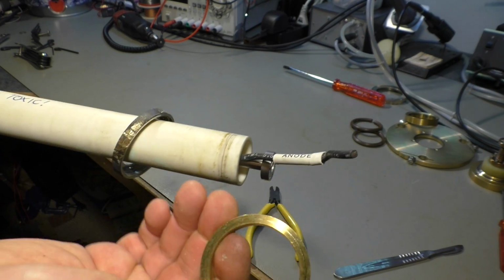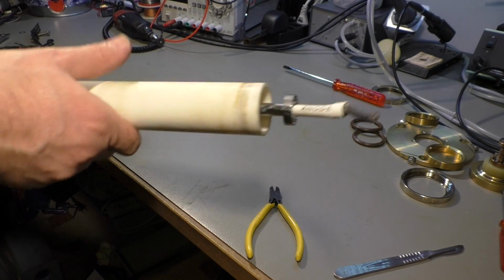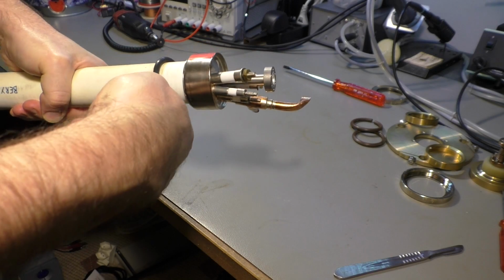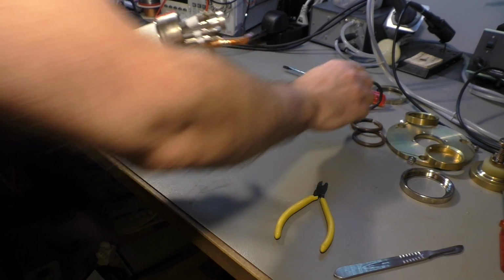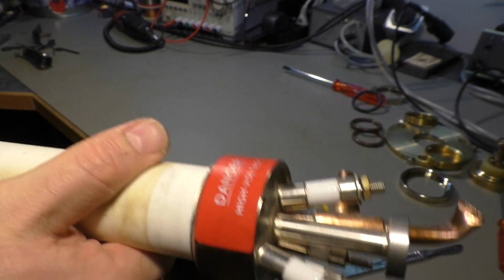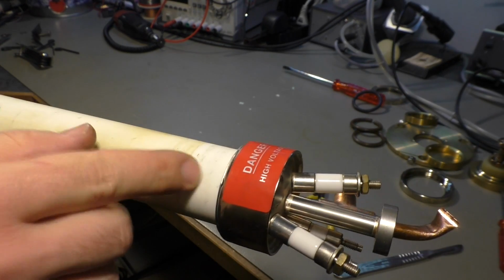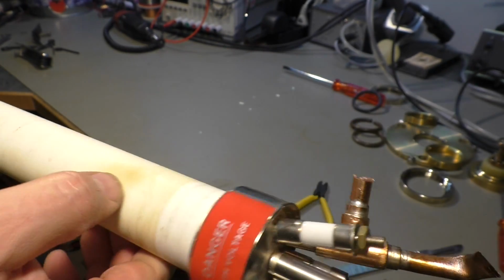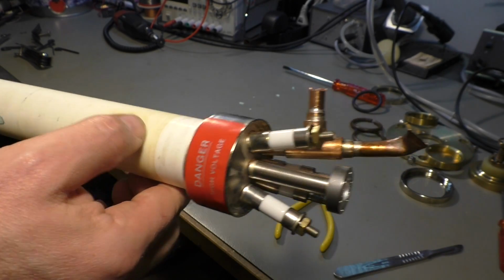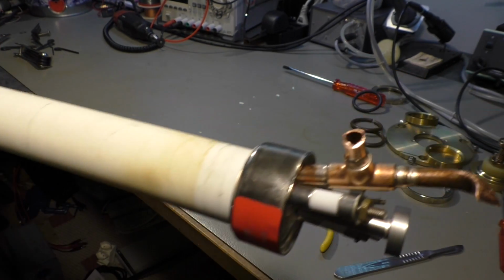It's the same brass ring as on this end, of course. It has the same function. Okay, I think there's not more we can disassemble here, because I already said it, it's too dangerous to open that stuff. I don't want this dust in my apartment here. Okay, let's see what happens with the other parts.